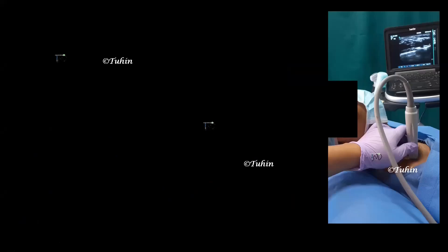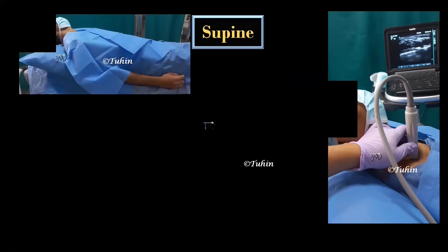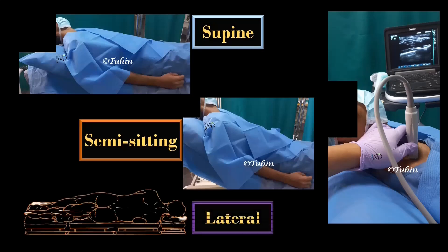The patient is placed in supine position with the head end of the bed slightly elevated. Alternatively, semi-sitting or beach chair position can be used. The head is turned towards the opposite side and the ipsilateral arm is adducted. A pillow or folded sheet is placed under the scapula. Lateral position can make probe placement and needling easier, especially in challenging patients.